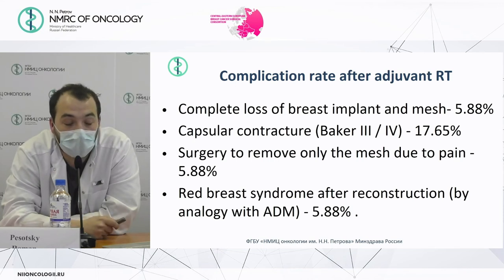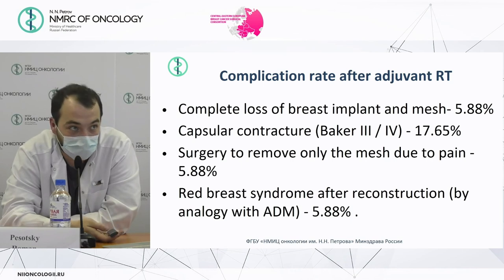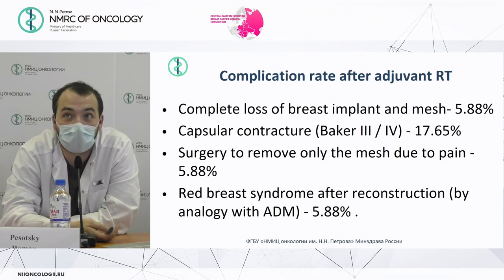We did that because the patient could feel the mesh and it was really painful for this patient. So we did a reoperation, removing only the mesh and covering the implant with the pectoralis major muscle. And we found red breast syndrome after reconstruction, by analogy with ADM, in one case. So this is really interesting.